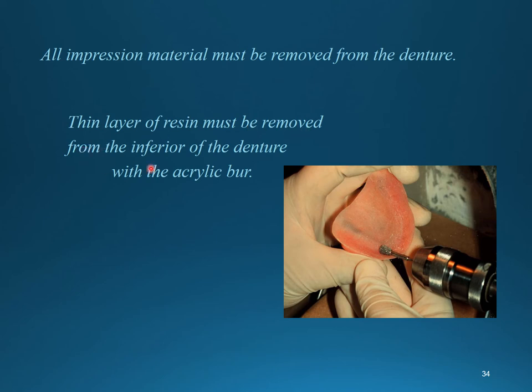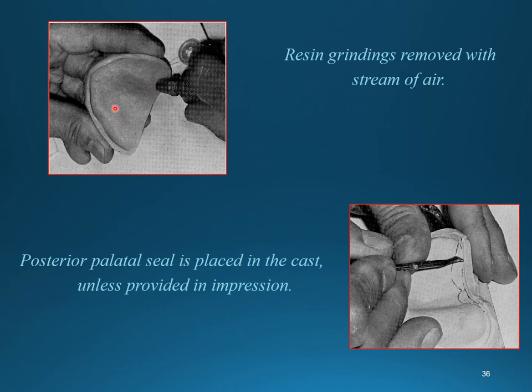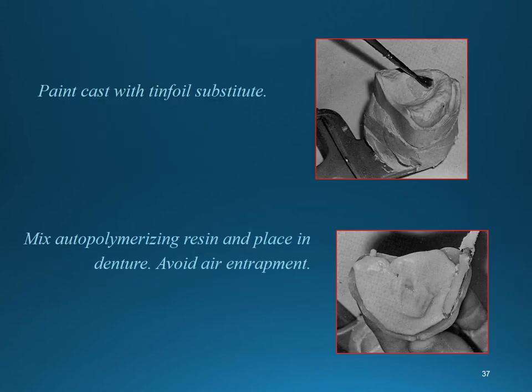A thin layer of resin is removed from the inferior surface of the denture. Borders are reduced 2 to 3 mm, and any notches are deepened. Any remaining resin material is removed from the cast. The post-palatal seal (PPS) is highlighted, drawn, and deepened in the cast using a carver or instrument.